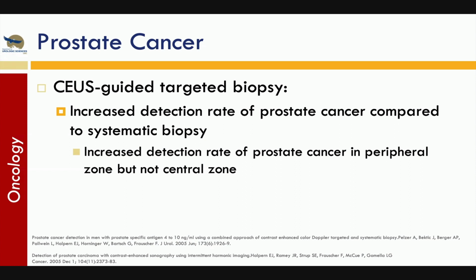Interestingly, it only increased detection rate in the peripheral zone, but not the central zone. And the idea of this whole thing was that prostate cancer nodules tend to show early enhancement after the administration of the microbubbles, the contrast agent, due to the increased vascularity, thus the guided biopsies.